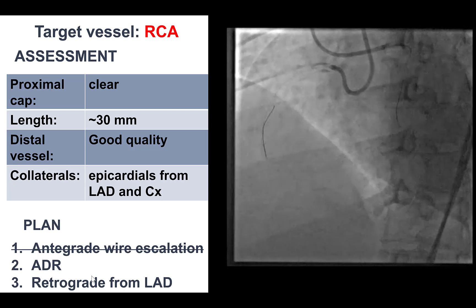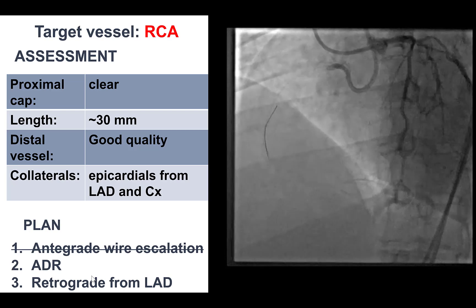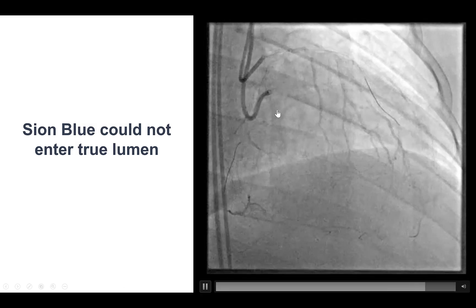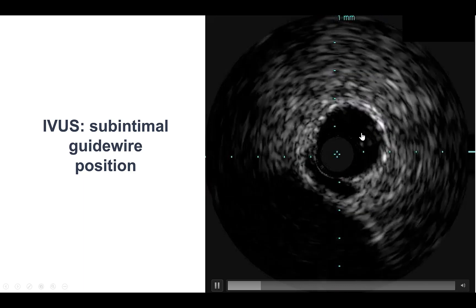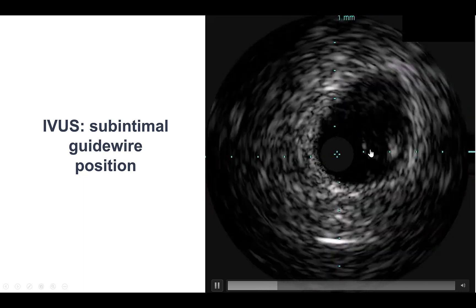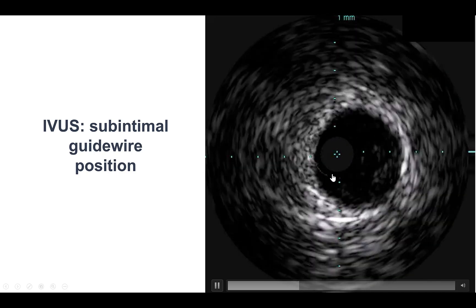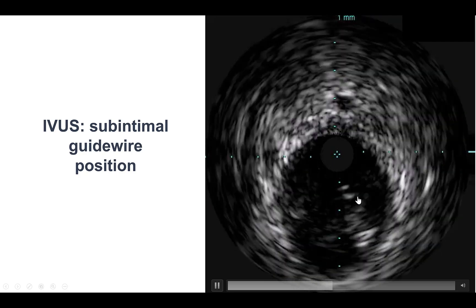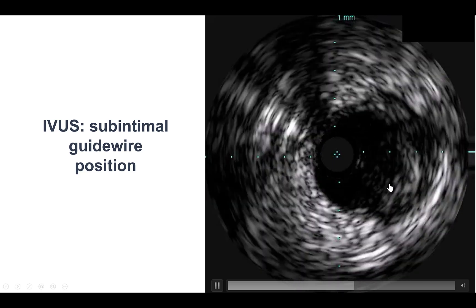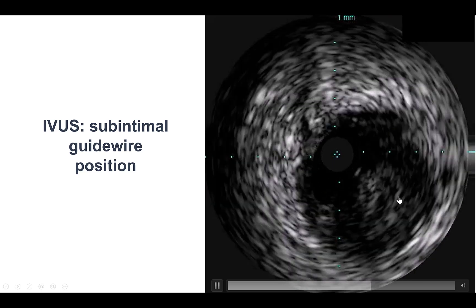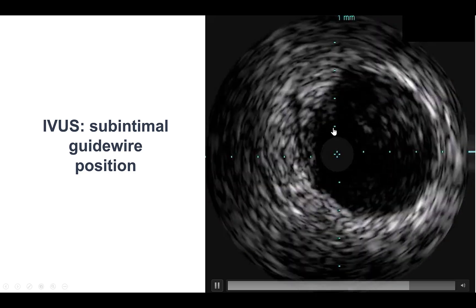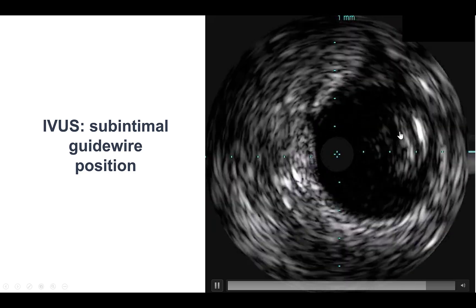Another approach could be to just let the right coronary artery recover and have the patient return for another attempt. We tried other workhorse guidewires, but they could not enter into the true lumen. The subintimal position of the guidewire was confirmed by intravascular ultrasound. The true lumen is actually compressed at two to three o'clock, and the IVUS catheter and the guidewire are located in the subintimal space. We also notice here that there is a compression of the true lumen, which could potentially make re-entry very challenging — which was indeed the case as we'll see shortly. Here is the true lumen, here is the subintimal space — a large subintimal space making re-entry into the true lumen quite challenging.